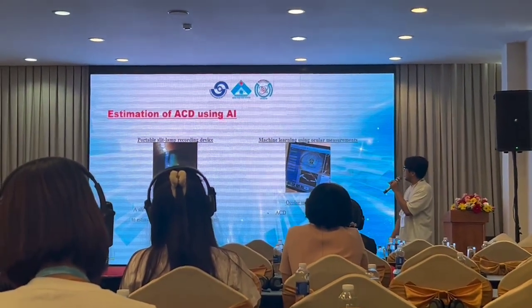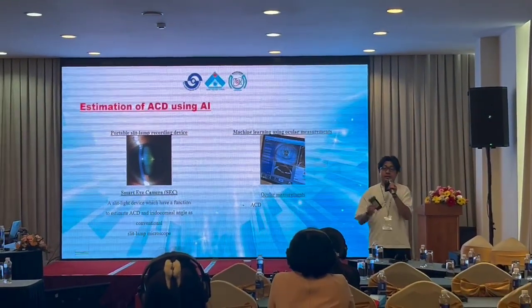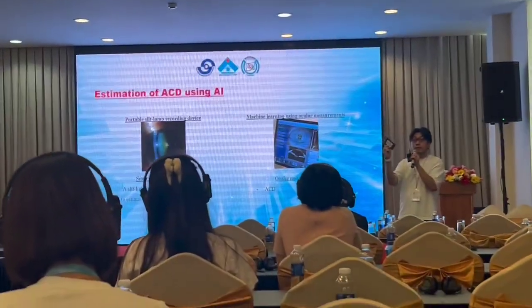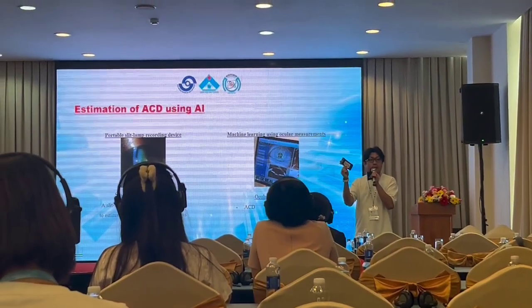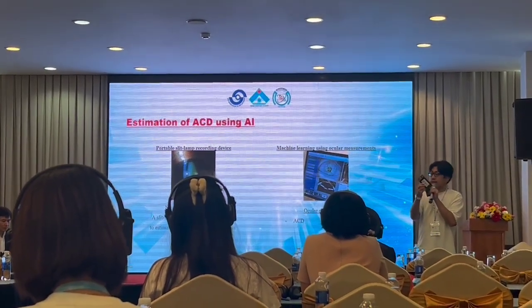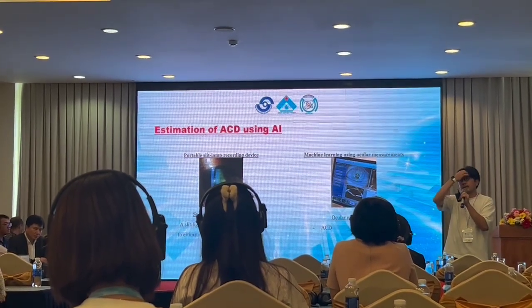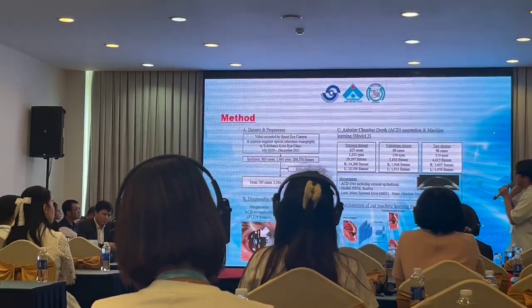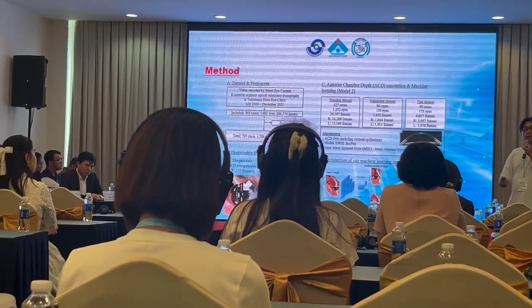Now, we use the portable slit lamp recording device. We call it the Smart Eye Camera. It has the same function as the slit lamp microscope. We already have evidence that this tool has the same efficiency, same capability to measure the anterior chamber depth versus conventional handheld slit lamp microscopes. We use anterior segment OCTs to measure the ACDs. This is a little bit complicated. I'm sorry, these are figures taken from my paper, but it is a pretty simple protocol.